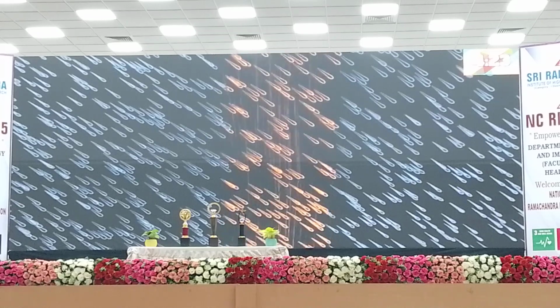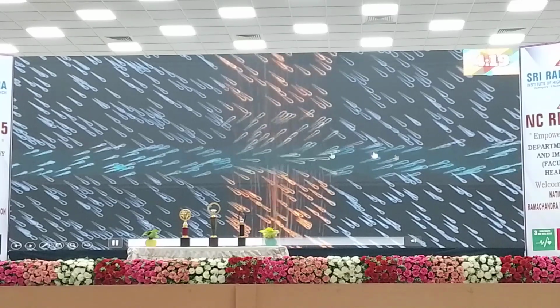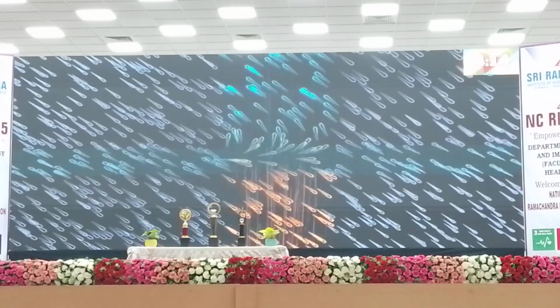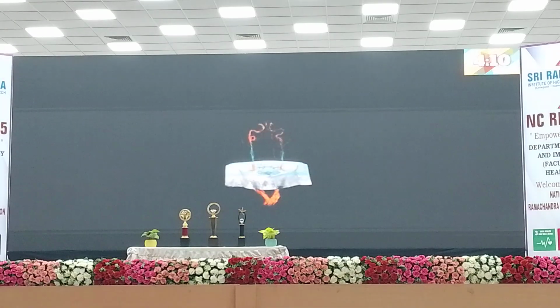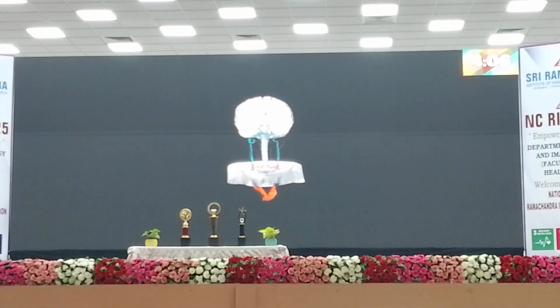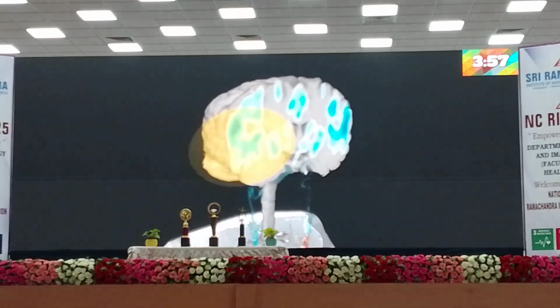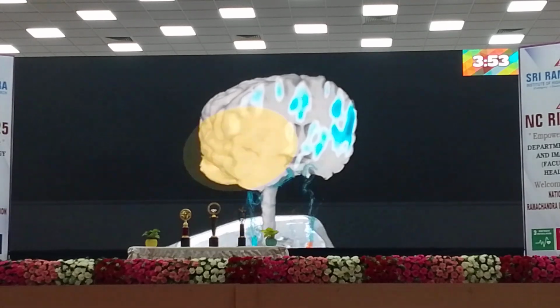The protons are moving there. Here you can see we are applying the inverted RF pulse, which means signal loss, and we acquire the image here. So you can see the moving blood here. It is perfused, and these are all advantages of ASL. We are using blood water, H2O, so it perfuses everywhere in the brain.